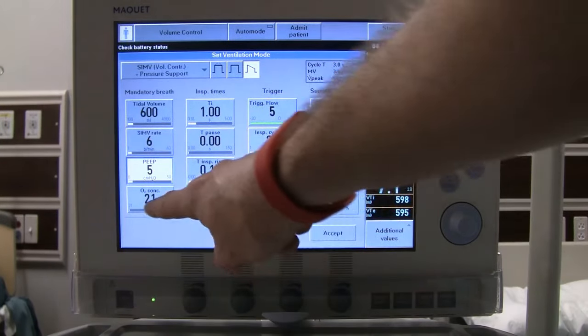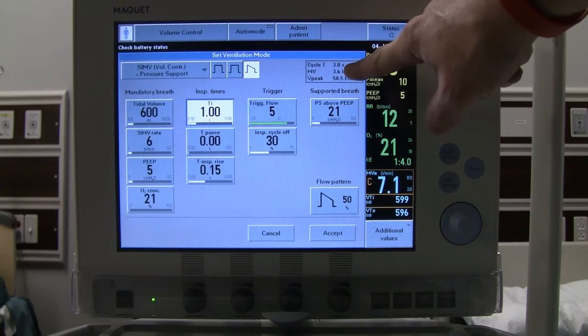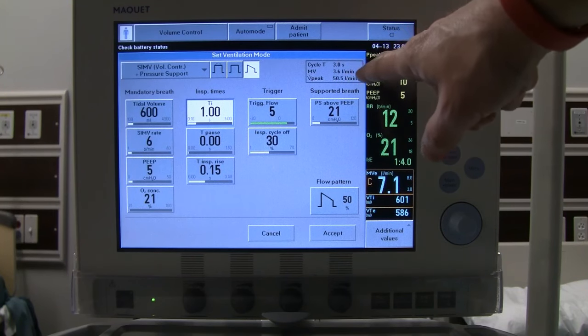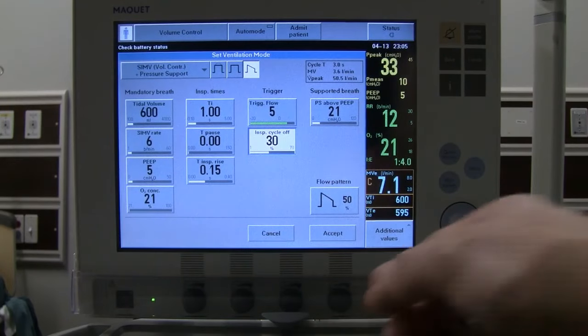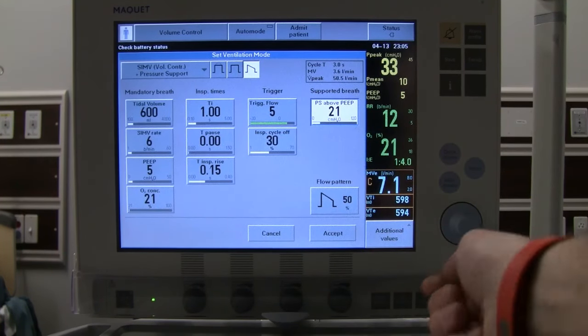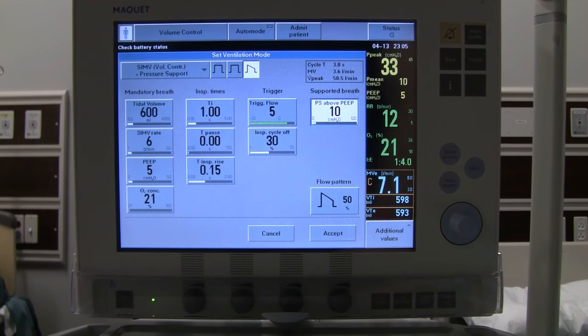We still have PEEP of 5 and FiO2 at 21%. The I-time can stay the same, though in SIMV you'll notice the I-to-E box is no longer available since I-to-E fluctuates with spontaneous breathing. Pause stays at zero, rise time at default, and we still have our trigger. We also get an inspiratory cycle-off in this mode. We can set pressure support above PEEP — we'll set it at 10, which is the actual driving pressure delivered above PEEP.